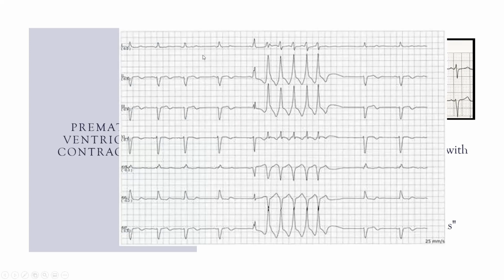Lots of people walk around with PVCs, don't even know it until you hook them up to a monitor and they're like, oh my God, what is that? It's a PVC. Typically, it might even feel like a tiny little flutter or a skipped beat of the heart. Some people who are very in tune to their bodies might feel them. And again, they don't become problematic until you start having these longer periods of PVCs.